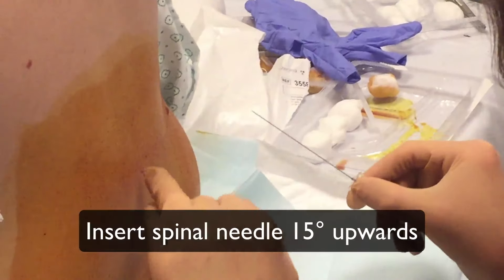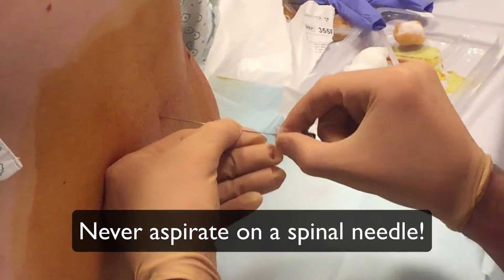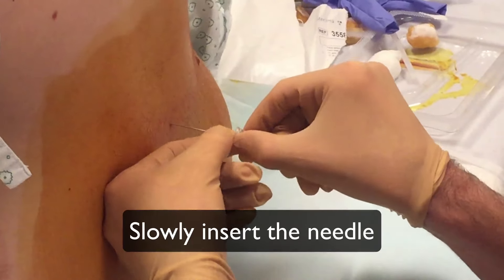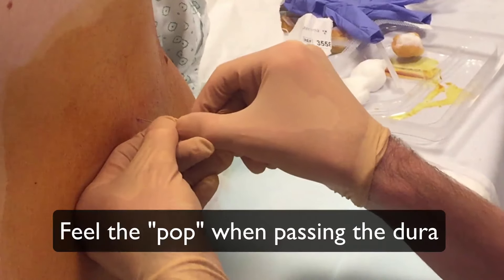Insert the spinal needle in the midline and 15 degrees upwards. Never aspirate the spinal needle. Slowly insert the needle deeper and regularly retract the needle introducer to see if fluid comes out. You might feel a pop while penetrating the dura.